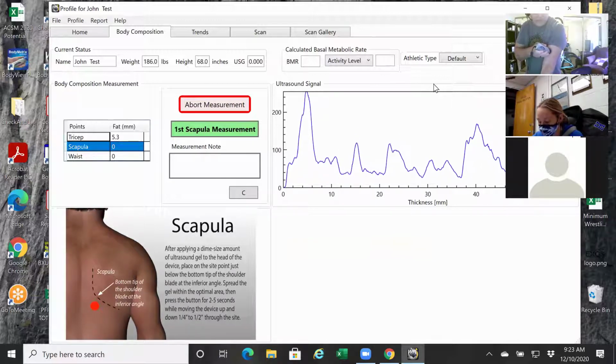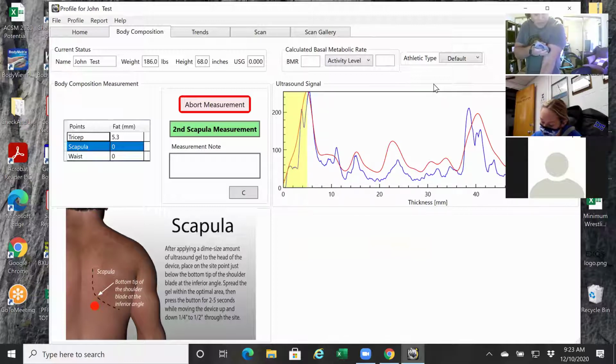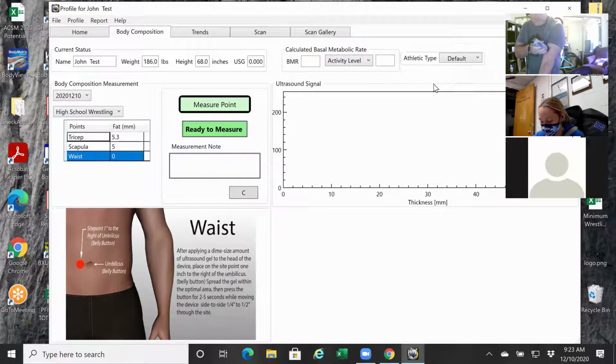I'm going a little bit faster than 3 or 4 seconds, but I think you get the idea. We'll repeat that. It's just a nice, comfortable, fluid speed through the point, okay? And in this case, it asked for 2 readings. Now note, I'm not trying to toot my horn, but note that the measurements are super close together. We're talking like 0.3 of a millimeter. It's like trying to split a hair, just to show you the accuracy and repeatability of the system.